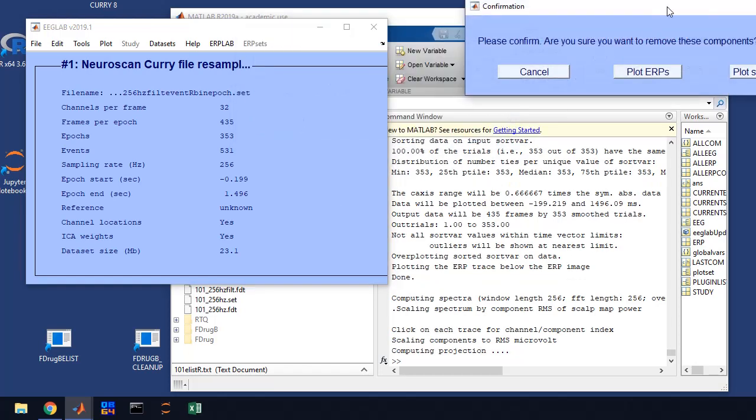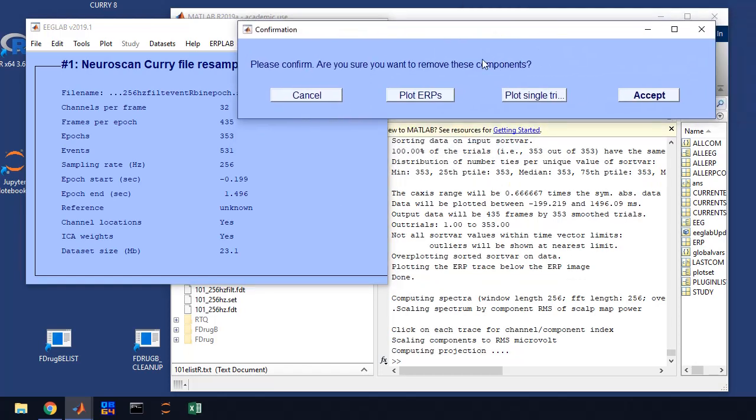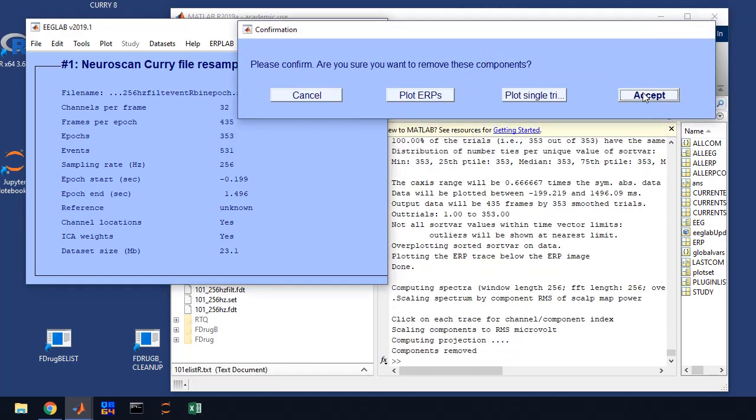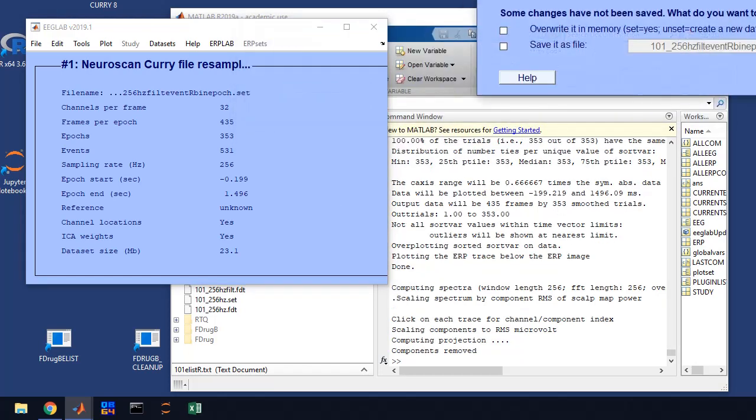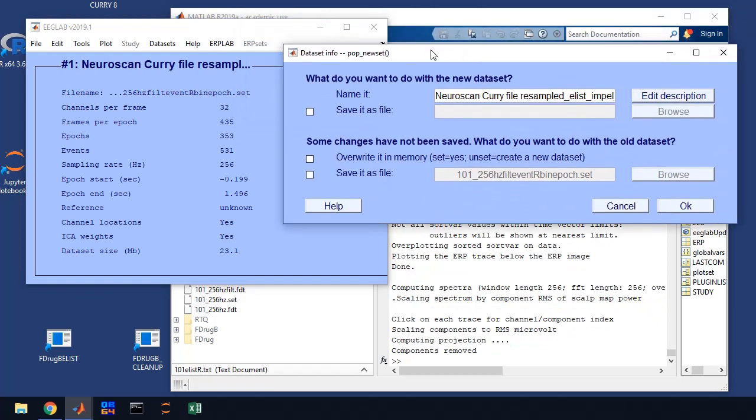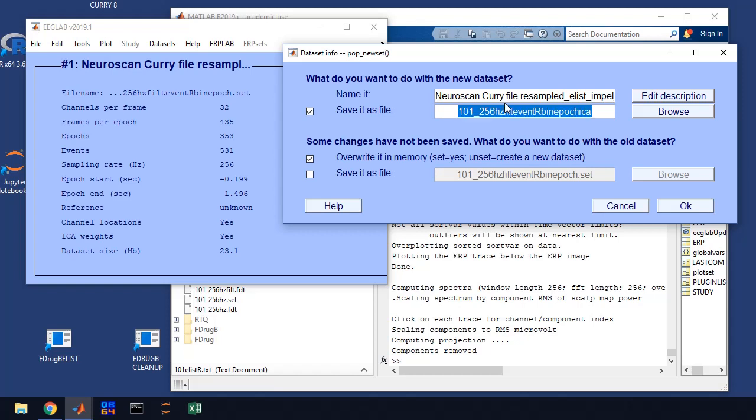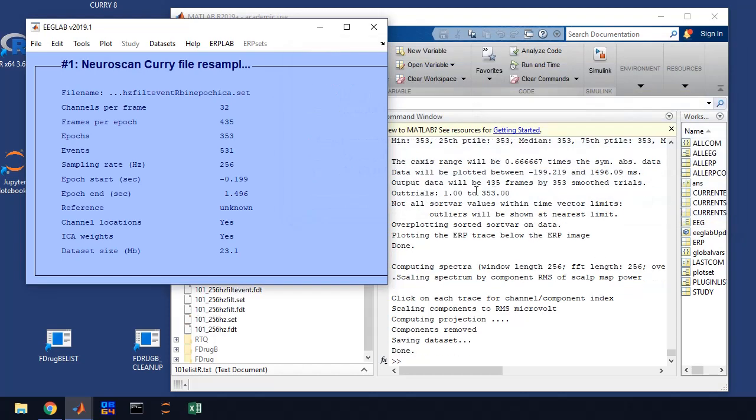It's going to say, Hey, do you want to accept that you're removing these? Yes, we do. Now it's asking you to save it. And we're going to overwrite it and we're going to paste it in here. And we're going to do ICA because we've cleaned it up with ICA. We're going to save that. And we're done with this individual step.